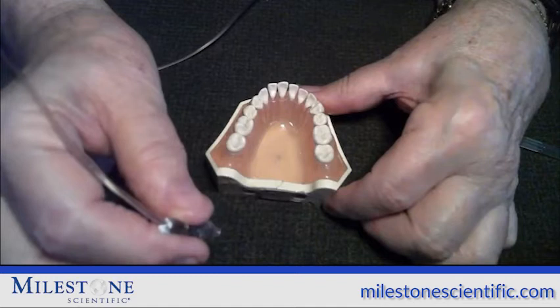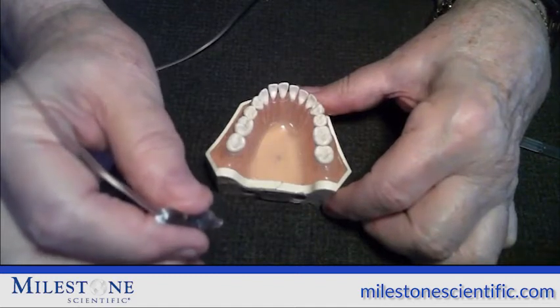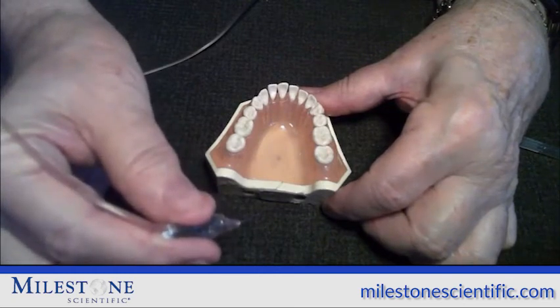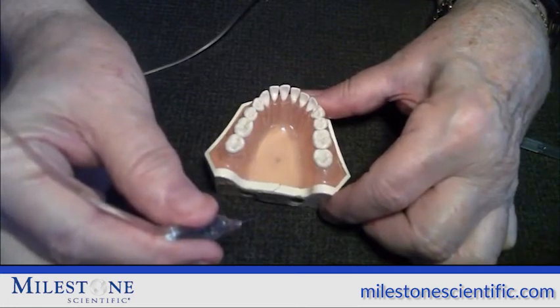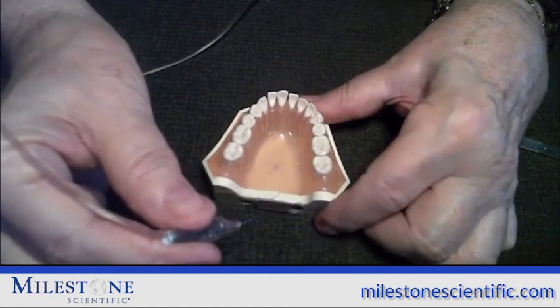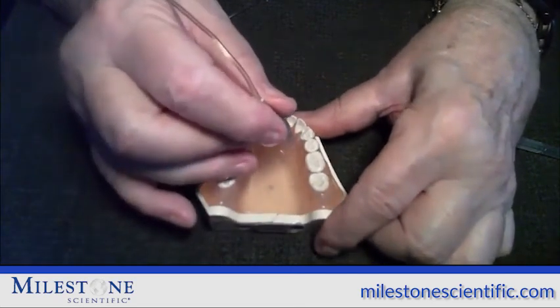If it's 1 or 2 drops, that's perfect. You're going to have excellent anesthesia. All the anesthetic went into the bone. But if you see 10, 20 drops, a steady stream of anesthetic coming out of that needle, then probably you're not going to have sufficient anesthesia, at least the anesthesia that you want, that should last approximately an hour. So the next time, just do much lighter placement of the needle and holding of the needle in place.